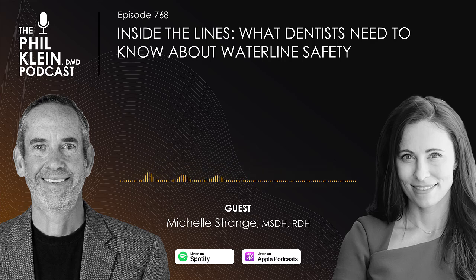So most dentists assume that the water coming out of their dental unit is clean and safe for patients. I did when I practiced. But what many dentists don't realize is that dental unit waterlines can quickly become one of the most contaminated systems in the entire practice. So let me start with this: how big of a problem is dental unit waterline contamination, and why should every dentist be paying closer attention to it? Our little dental units are just a breeding ground because we have these tiny little tubes.